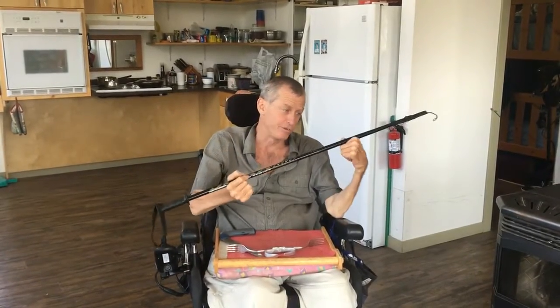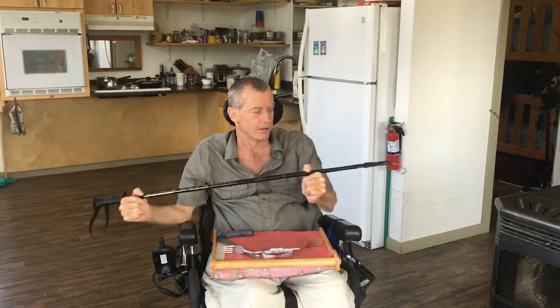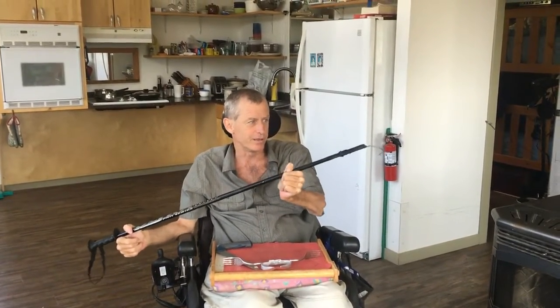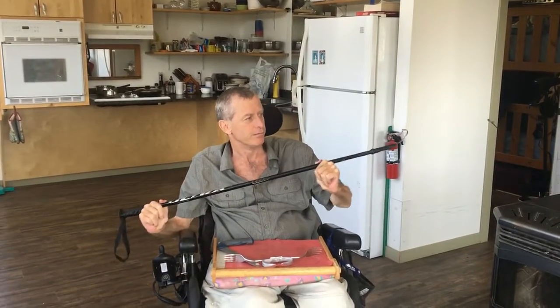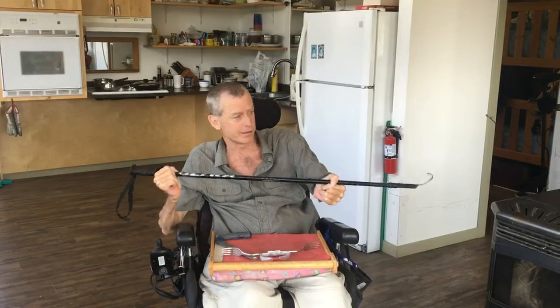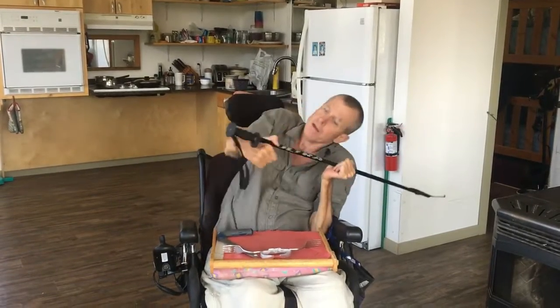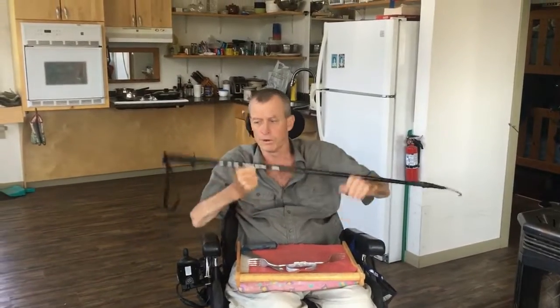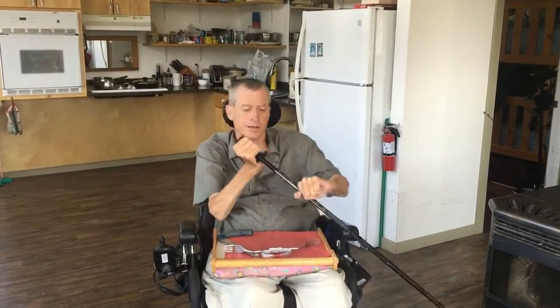And next one. This is a whole ski pole. It's not even broken. Just pop the basket off the end of it. Once again, zip tie a hook onto it, made from a metal coat hanger, which you can get dozens for $1 at the secondhand store if you want. And the nice thing about ski poles is that they're super light, and they have a handle on the end of them, a nice grip. So you can just kind of wander around like that.